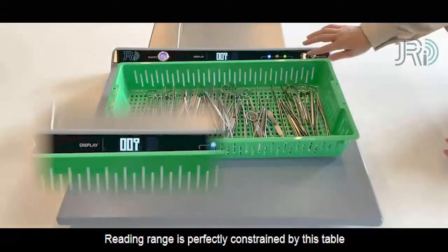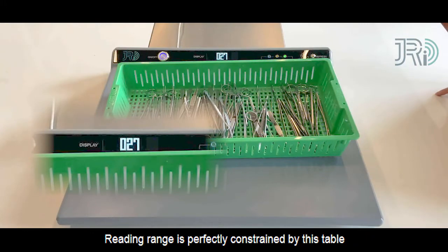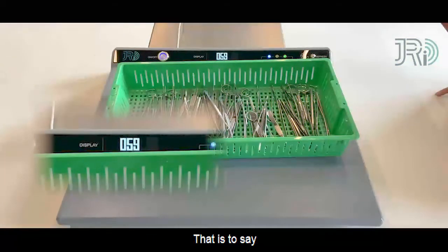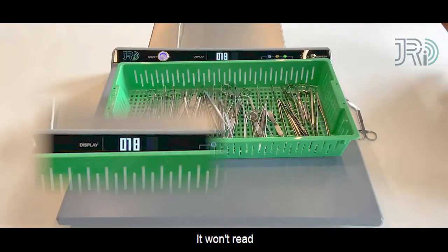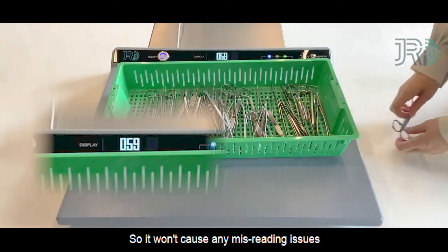The reading range is perfectly constrained by this table. That is to say, if we put instruments outside of the table, it won't read — so it won't cause any misreading issues.